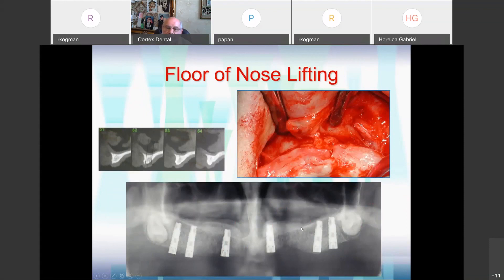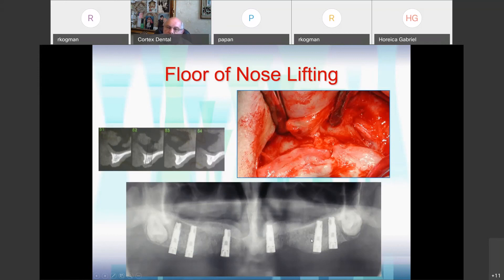Also, sometimes we have insufficient height in the frontal area. So we can do, similar to sinus lifting, a floor-of-nose lift — we raise the floor of the nose. It is even easier to separate the nasal mucosa, insert bone in place, and then insert implants. We start with such a case and you can see a nice 13 mm implant with final restoration.